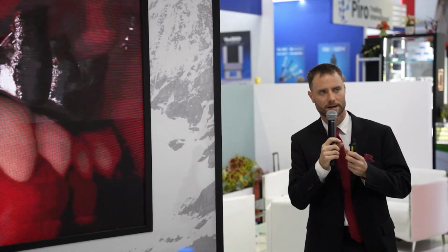When we talk about implant positioning, if you fail to plan, you can have real complications. If your implant is not exactly in the right position, you might have a nicely osseointegrated implant, but a complication with the prosthodontic part. That's only a minor complication, but it will obviously influence aesthetics.